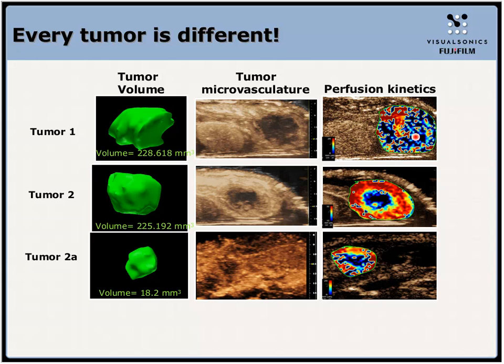Okay, tumor number 2, in its earliest form, when it's only 18.2 cubic millimeters, that means before it is even palpable, can be visualized, scanned, further analyzed and reported. And you see that if you compare the two, even early on, it has a similar perfusion pattern.